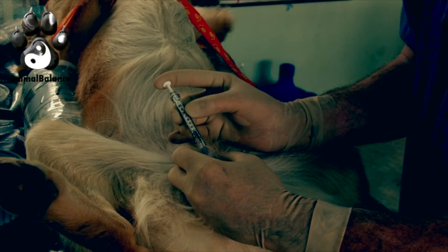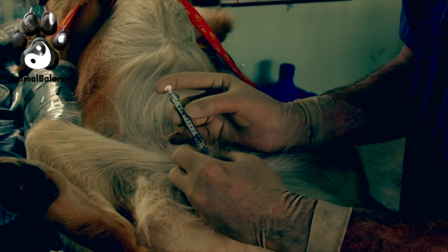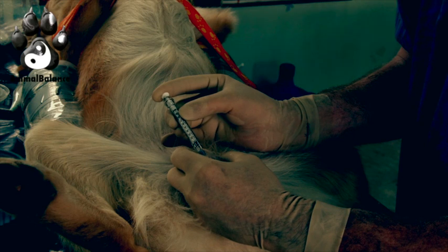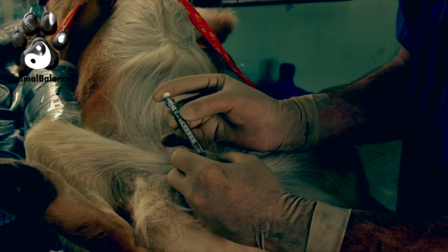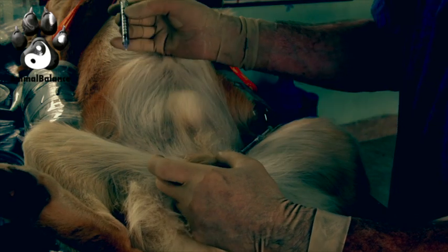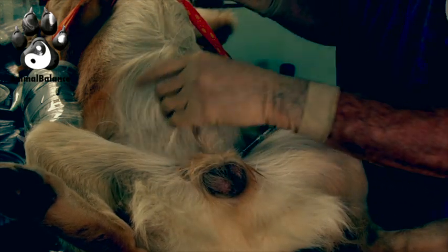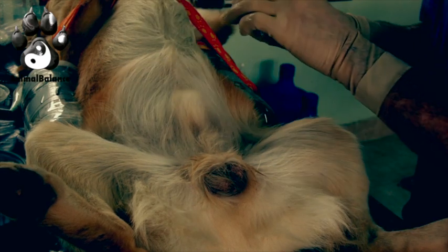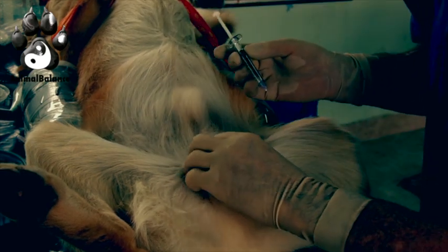I inject very slowly — this injection technique should last about 10 to 12 seconds. The reason we go nice and slow is to avoid stimulating the pressure receptors within the testicle. At the very end, I hold it there for three seconds, take my finger off the plunger, and then simultaneously let go and pull out at the same time.